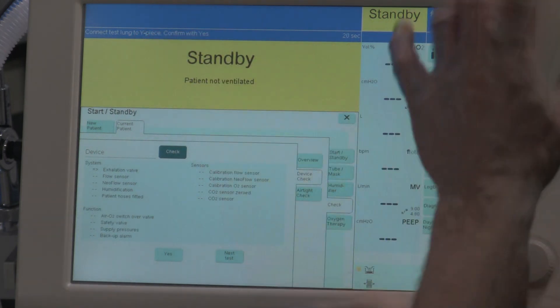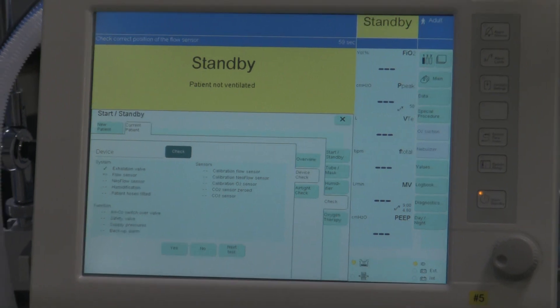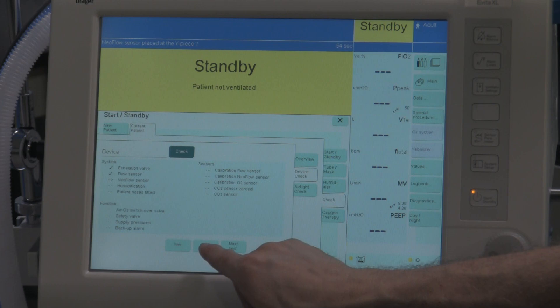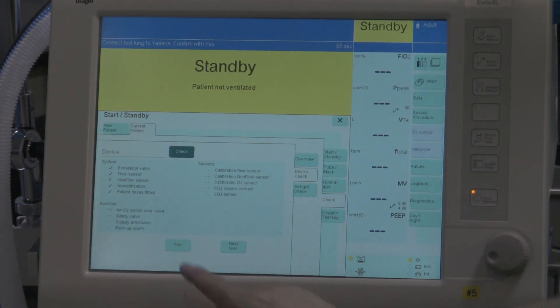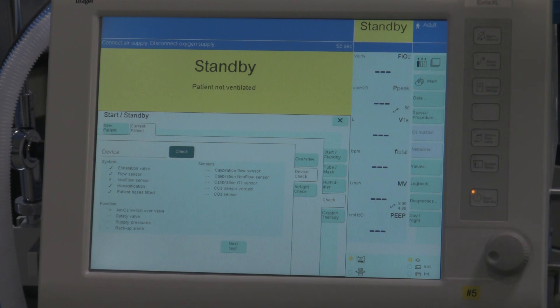Connect test lung to Y piece — we've done that, confirm with Yes. Now it says 'Check the correct position of the flow sensor' — looking at the flow sensor at the bottom, it seems to be in the right spot, hit Yes. Neoflow sensor placed at the patient? No, we don't have a neoflow sensor incorporated. Is the humidifier ready for use? Yes. Patient hoses connected correctly? Yes. Connect test lung to Y piece? Yes. Now it says 'Disconnect air supply, disconnect oxygen supply.' So we're going to disconnect the oxygen from the station outlet.